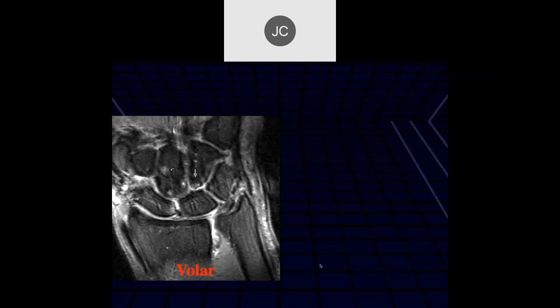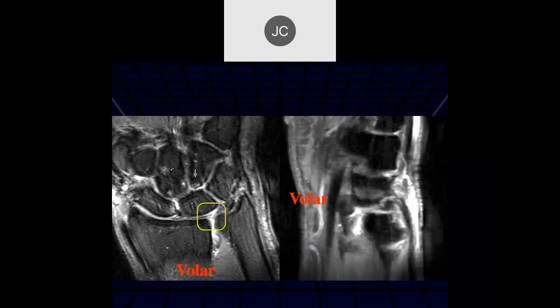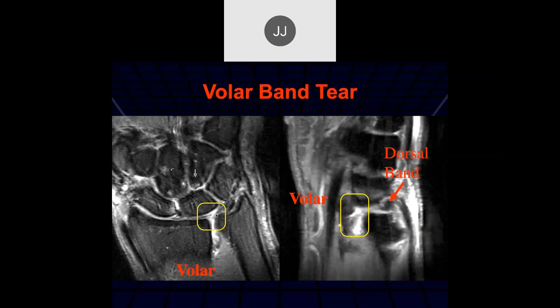Here again it looks like a tear or central perforation of that central disc. This is really going toward the actual insertion of the TFCC on the articular cartilage of the radius. You can see this is a very volar location — dorsal band, volar band — and this was a volar band tear. This is an older person, isn't it? Probably.